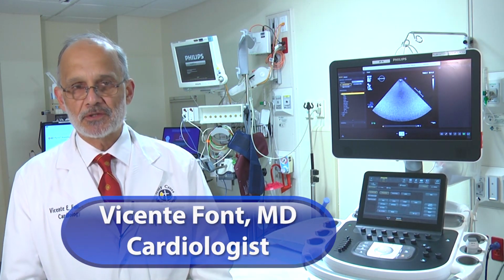Hello, I'm here to talk a little bit about a very common test that we do in the hospital and the office setting, and it's called echocardiography, or better known as echoes. Echocardiography is the primary non-invasive imaging modality for quantitative and qualitative evaluation of cardiac anatomy, physiology, and function.